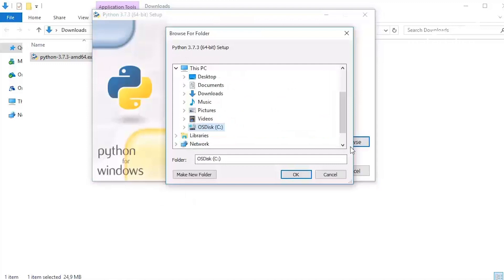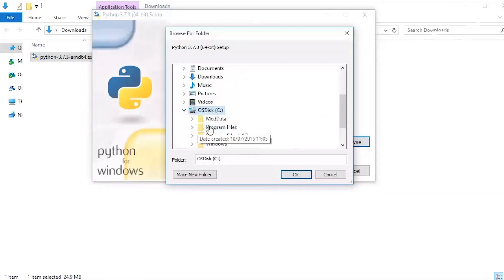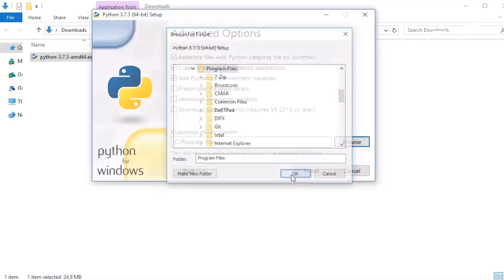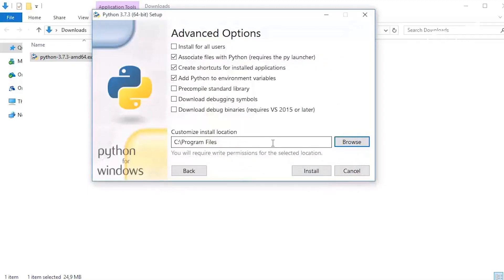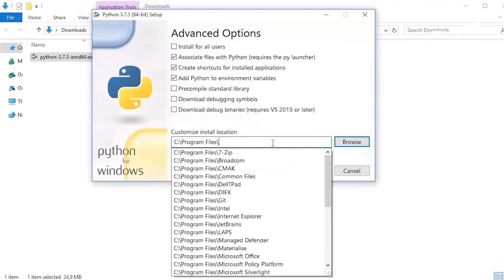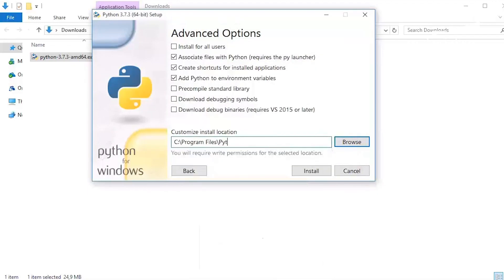Set the path to a convenient location, as you will have to refer to it later on. We will choose the Program Files folder and call the installation folder Python 3.7.